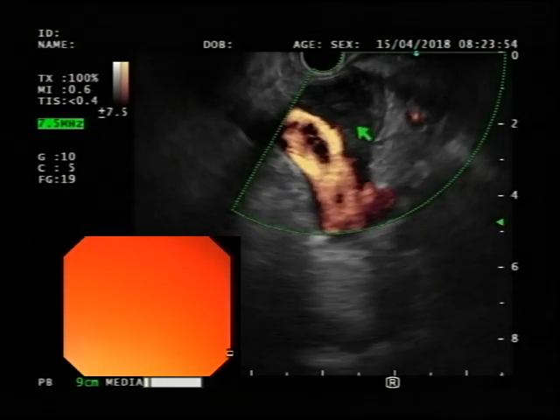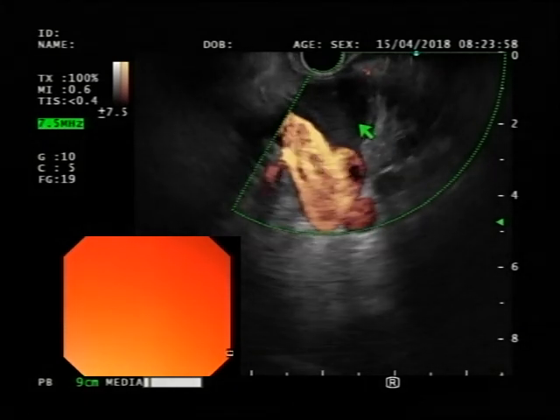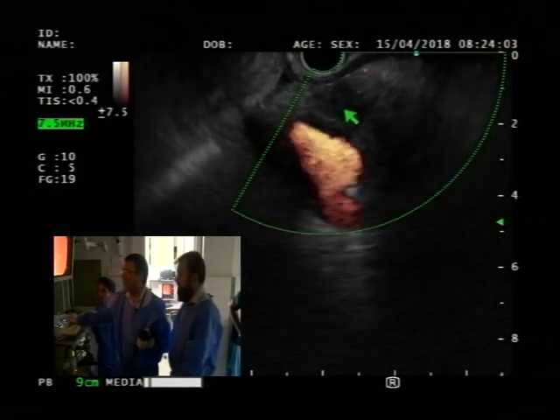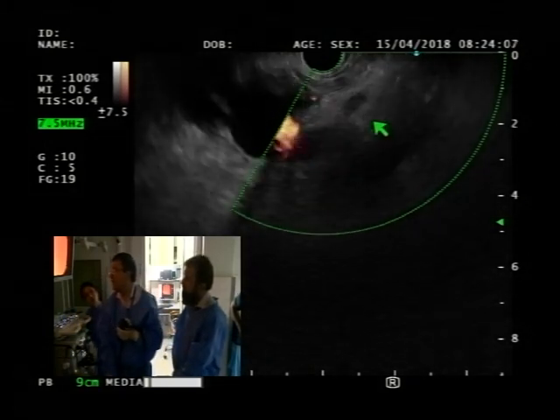This looks like a very typical clot. You guys see that clearly, right? Yes, yes, very clearly. Yeah, so I don't know if there is a need to do that. If you want, have a look at the body again and make sure, since they said that there's a mass. I don't think that we saw a mass at all.